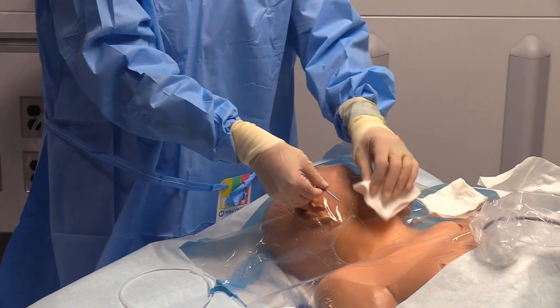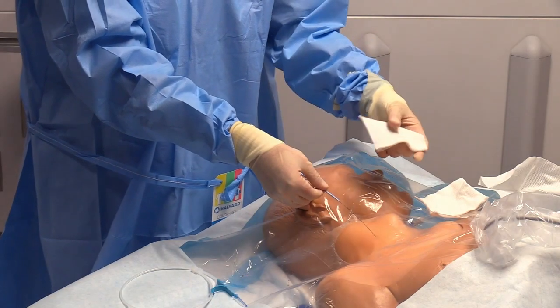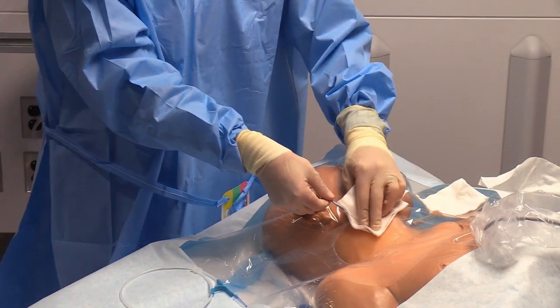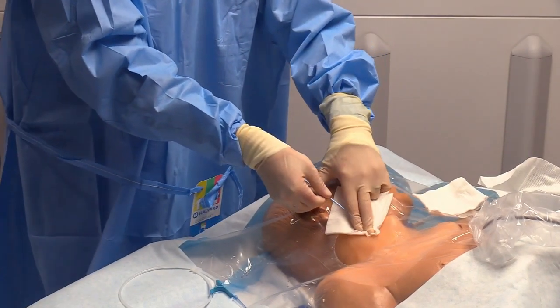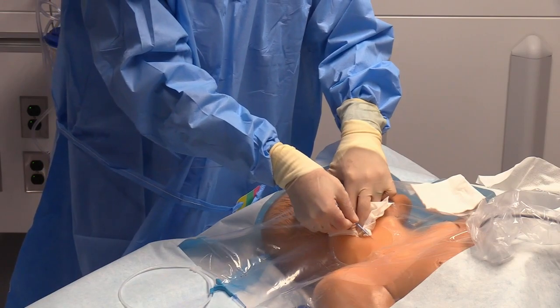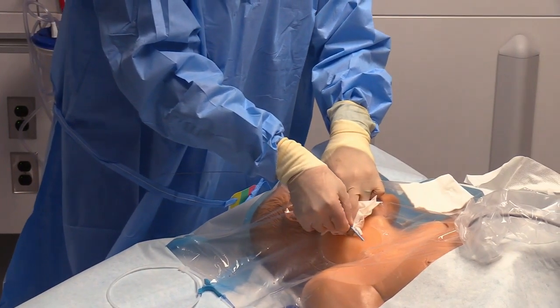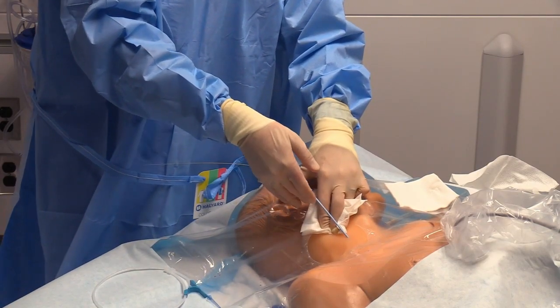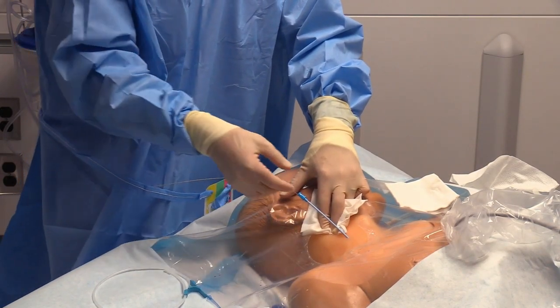If you have a friend, it's nice if somebody's sterile with you to be able to take a 4x4 gauze, especially for dialysis catheters, and pull the skin behind to make it nice and taut as you go in. So actually retracting behind as you go in the skin is very helpful. And dilate a little bit, especially with bigger dilators, but the triple lumen is not as big of a deal as it is with a dialysis catheter.